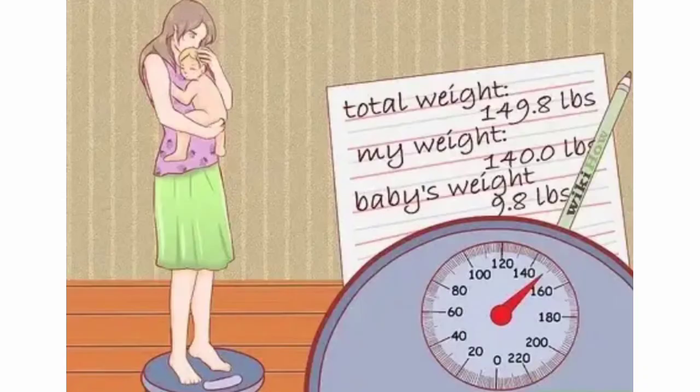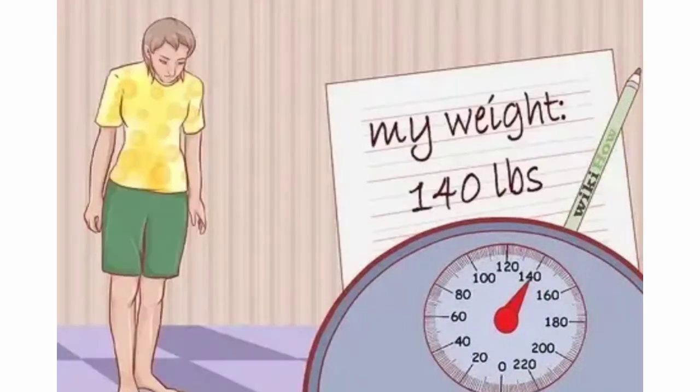Another way of measuring the weight in children that is sometimes used is for the kids who are unable to stand, or when the smaller scale is not available: first weigh the kid with an attendant, and then subtract the weight of the attendant. In this way you can also measure the weight of the child. This is also a way of measuring the weight of an adult.